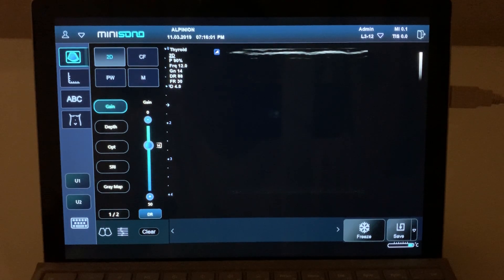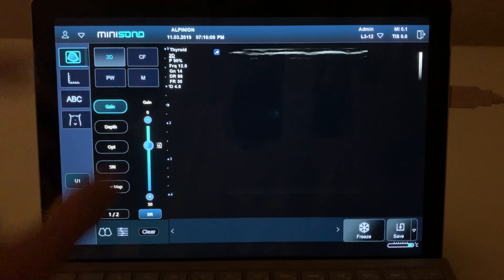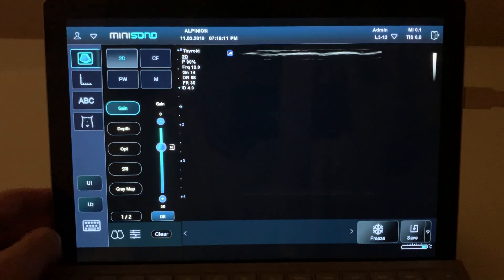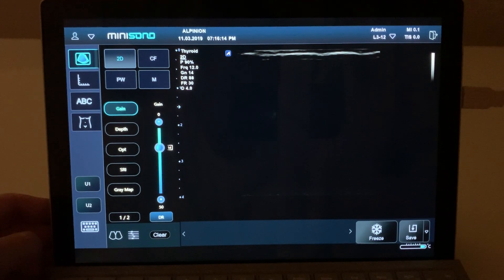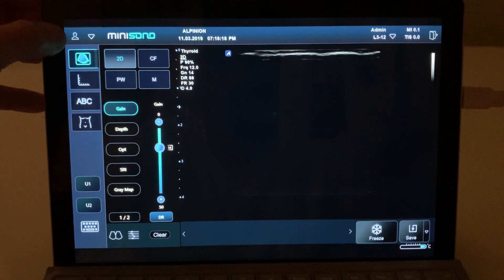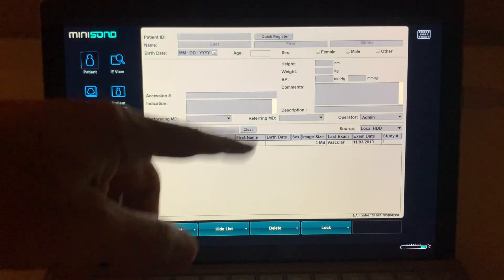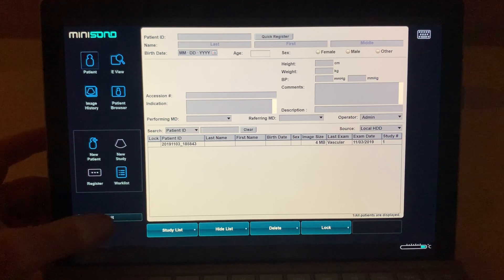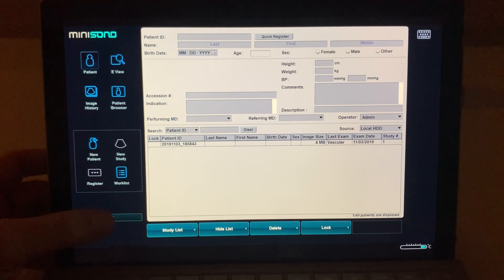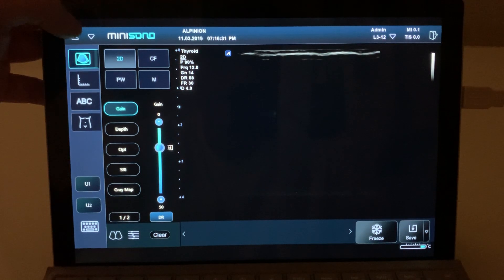Let's review the basic operation of the Mini Sono, a tablet-based ultrasound system. Here we can see the layout of the menus. In the upper left corner there's a little icon — when you touch this you will see the patient information form. If you want to exit, down in the left corner it says 'exit' and you can exit that.